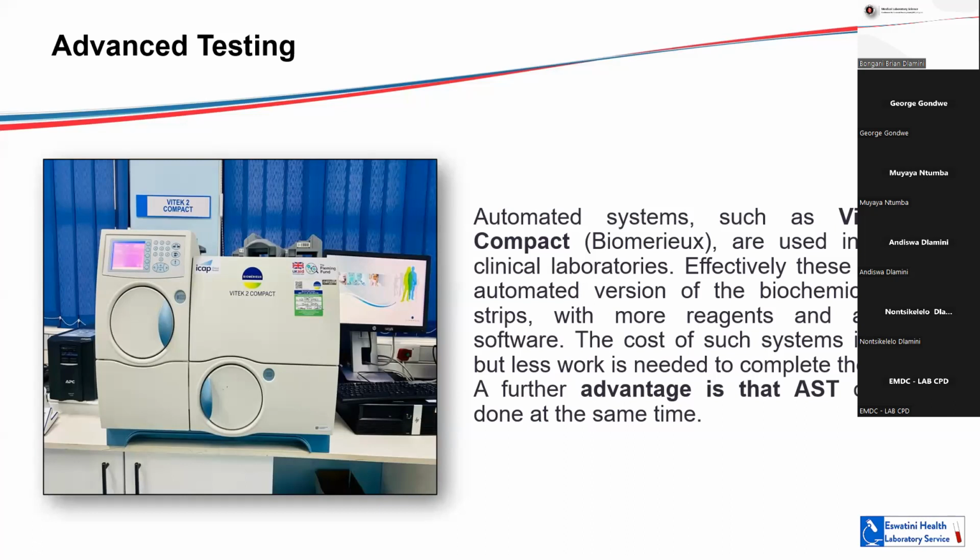Although it does have some limitations, as most tests, for some microorganisms, it cannot identify them to species level. For example, your Enterobacter species, it can give you Enterobacter species and not actually say the species.